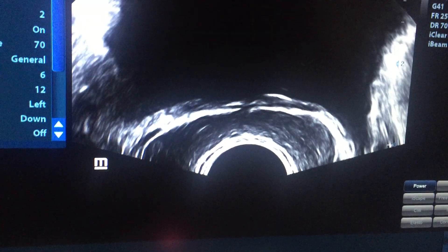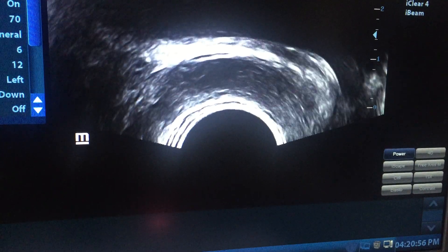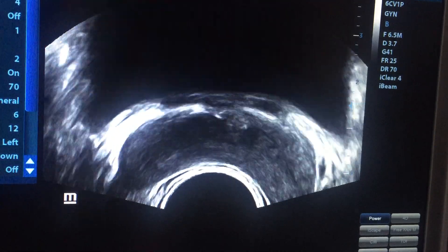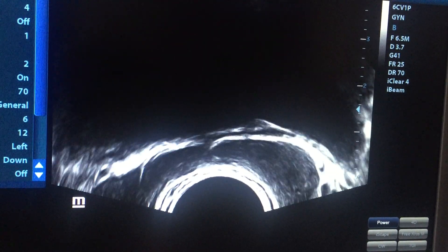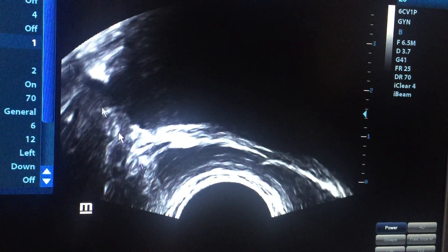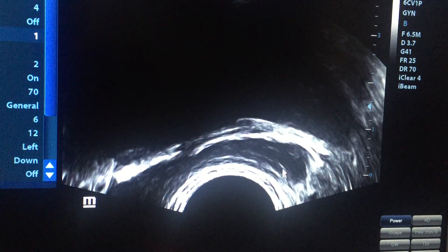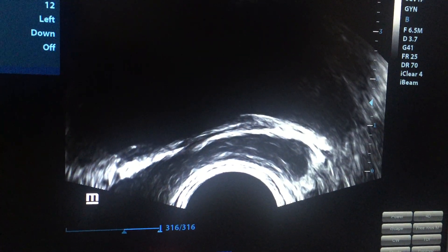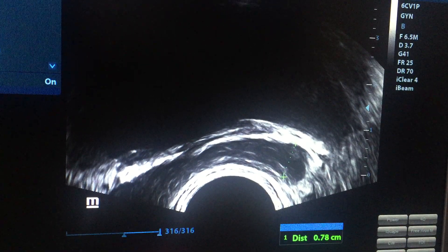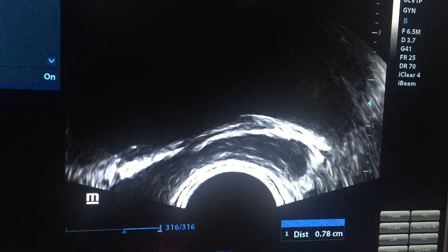These are the seminal vesicles. This is the right one — the right seminal vesicle — and this is the left one. This is a case of infertility. If you need measurements, place calipers like this and measure the anteroposterior diameter. It is about 9mm on one side and 8mm on the other.